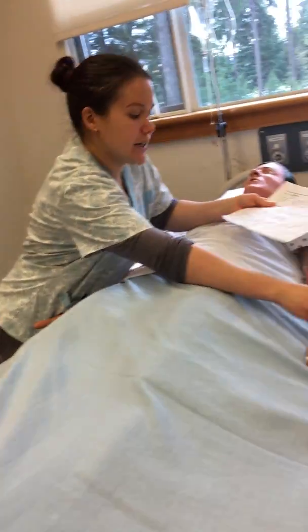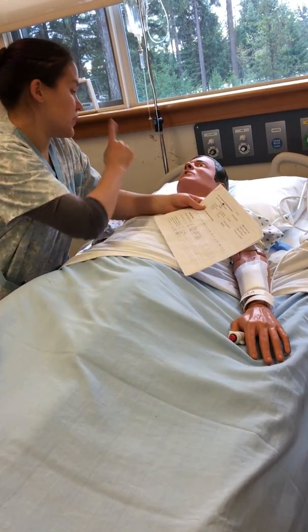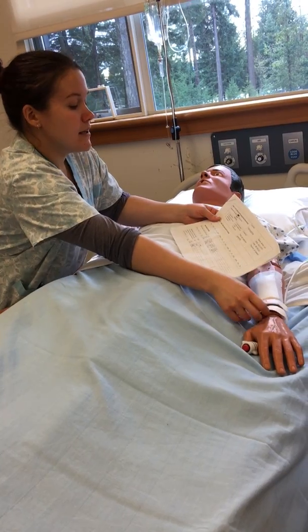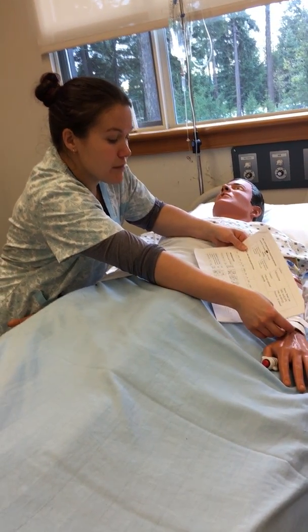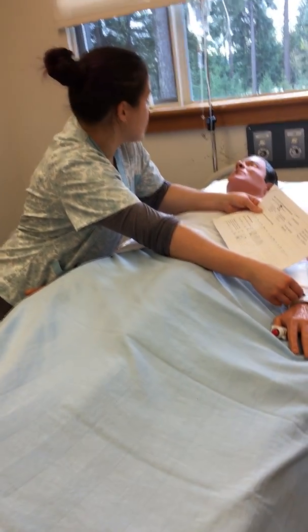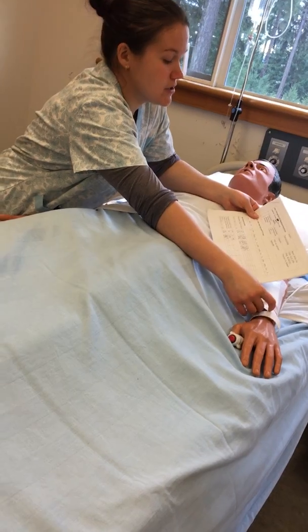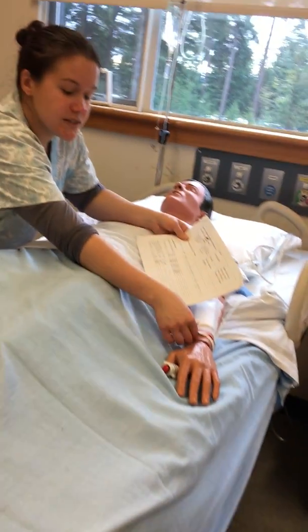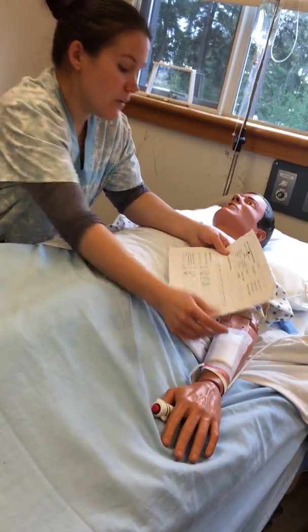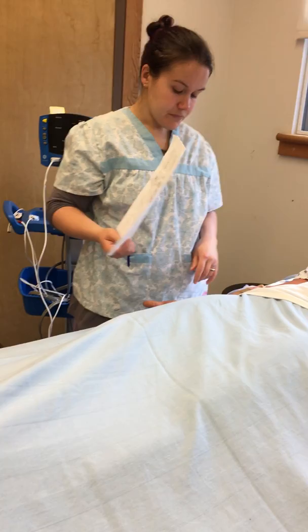I'm going to take my MAR, compare it against her bracelet, ask her her name, comparing what she says to this, ask her her date of birth, compare, and I'm going to compare her MRN. I'm going to ask her if she has any allergies. This one says NKA, which it definitely should not say because she's allergic to tetracycline, but I don't have the proper bracelets. We'll pretend that says tetracycline. Okay, that's good. I'm not giving you tetracycline, so you're okay.